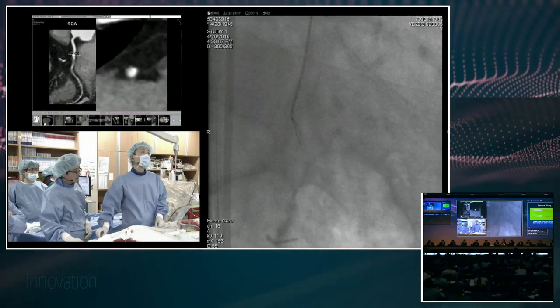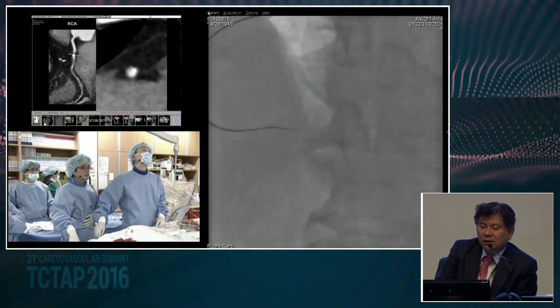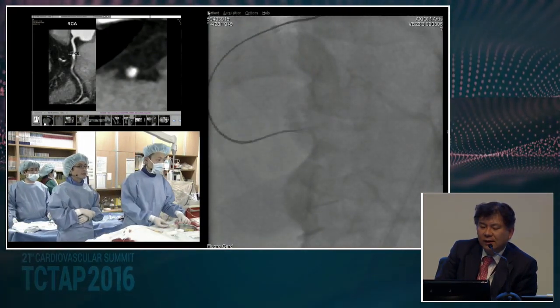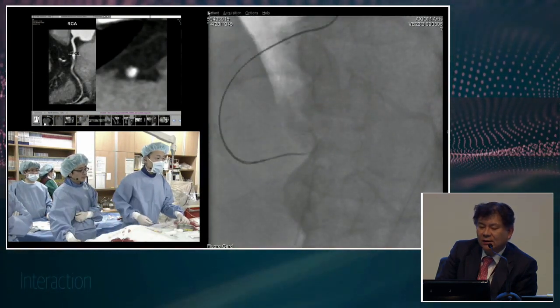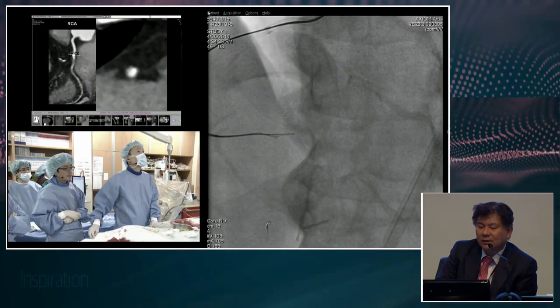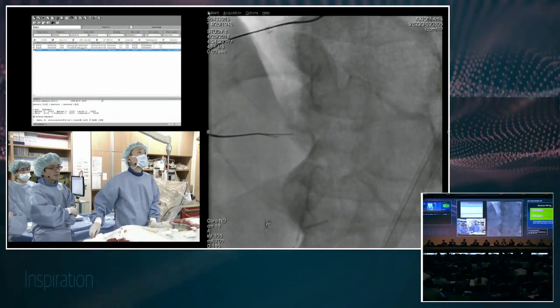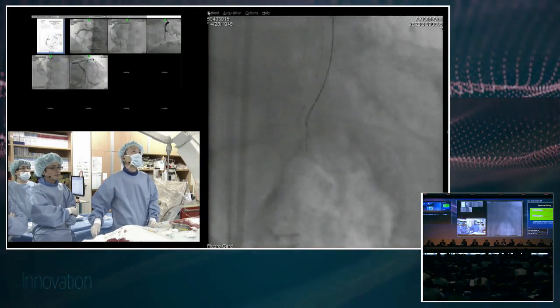Dr. Nasu? Yes? This is Dr. Ra. When I look at the angiogram, I feel this looks like a spontaneous coronary dissection from middle to distal with combined multi-channel. How do you feel during the wiring? So one was a possibility, but I'm not sure.